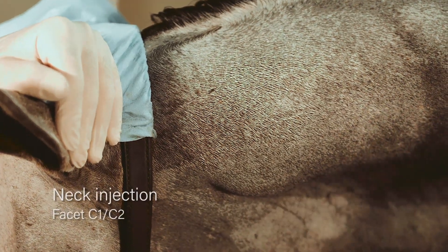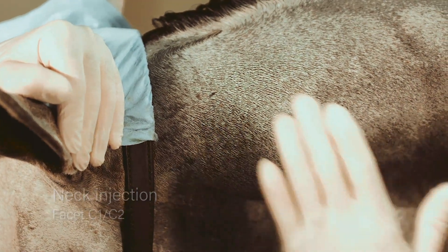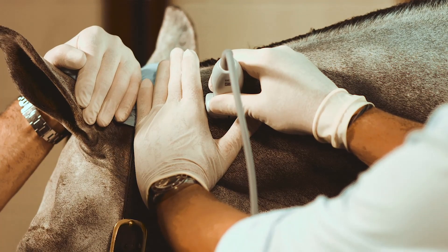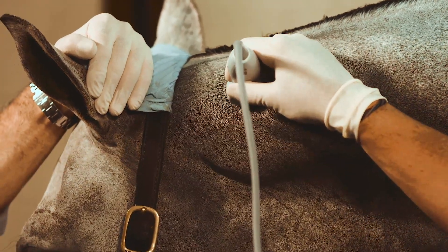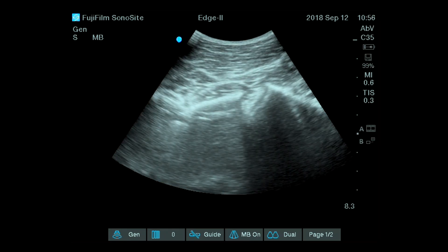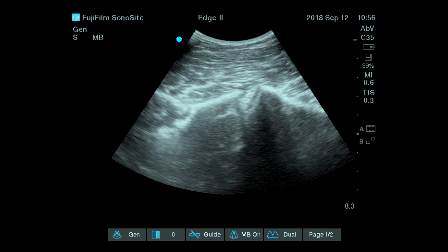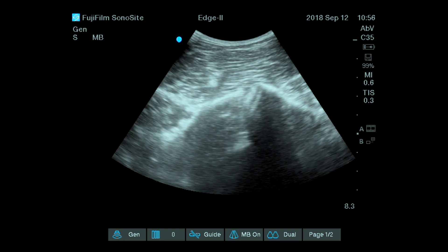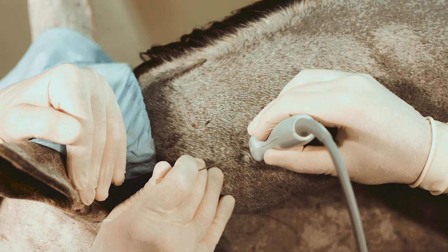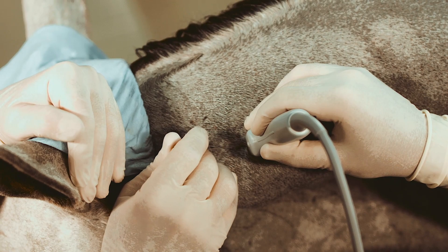We are going to show you the injection of the joint C1-C2 ultrasound guided. The landmark is to put your hand behind the ear and approximately five to six centimeters away from the midline — your probe will give you an idea where the joint should be. On the screen of the ultrasound machine you will see that we are just facing the caudal aspect of C1 and the cranial aspect of C2. The edge of the needle should meet the cranial aspect of C2. Richard Markel is going to inject this horse exactly in this axis and bring the tip of the needle on the edge of C1 and C2 with a bit more depth.